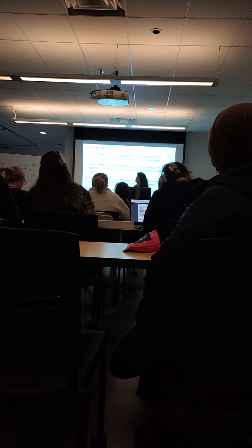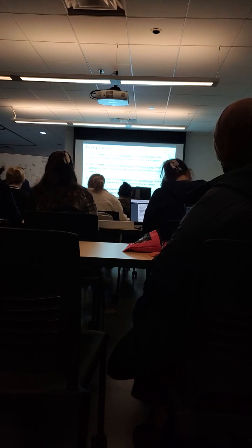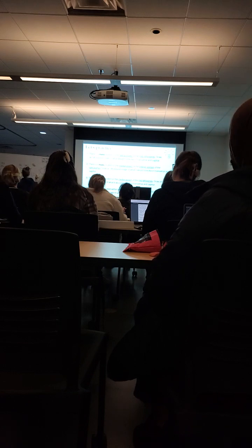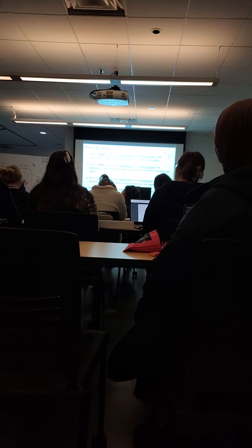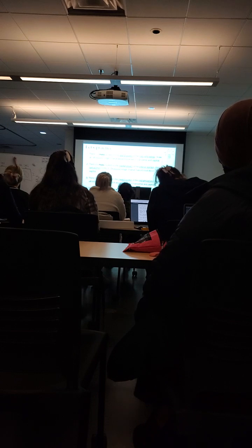Because this is the medial aspect and the inferior, transverse is going to be inferior. So it's going to be labeled inferior. It'll be right kidney transverse inferior at the top. I was thinking inferior because it says located in the medial aspect of the inferior portion. We're going to redraw these because we know we have to be inferior. We're not going to get the C shape, because the C shape is really when you're superior.